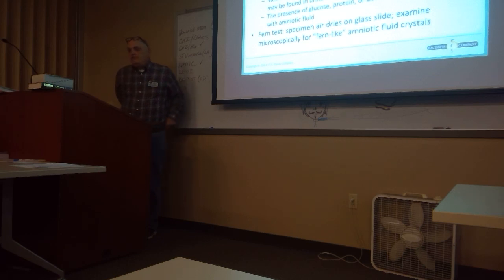Okay, maternal urine versus amniotic fluid. A lot of times we have to differentiate again, are we dealing with amniotic fluid or are we dealing with urine from the bladder? This test can be done to determine a premature membrane rupture or an accidental puncture of the maternal bladder versus amniotic fluid.